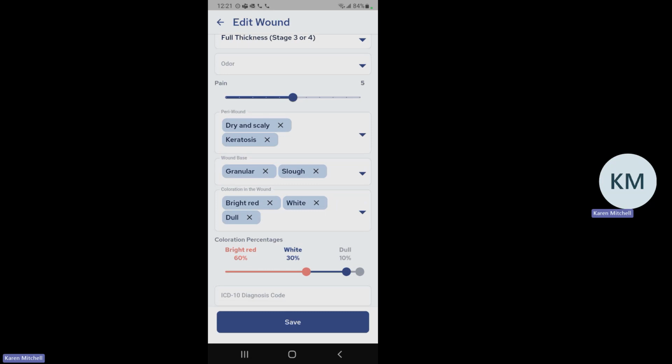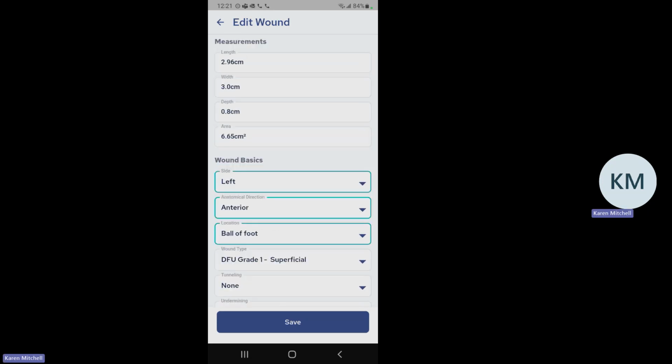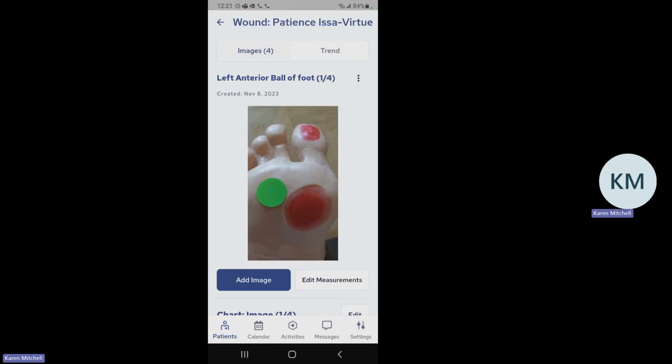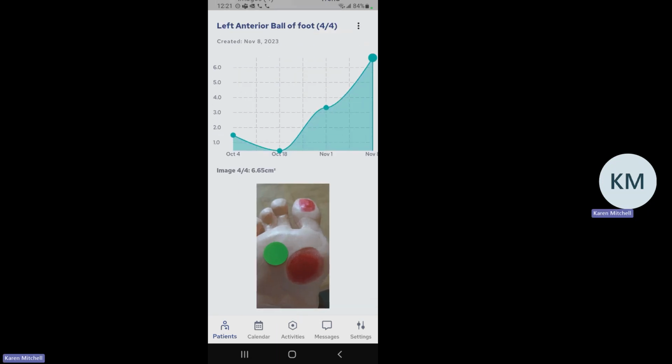And it's easy to use CarePICS in a visit. Take a picture, measure the wound, update the wound description, and send the report. The providers we serve gain clinical insights to the progress of their patients' wounds, and they can be confident in the quality of their wound documentation.